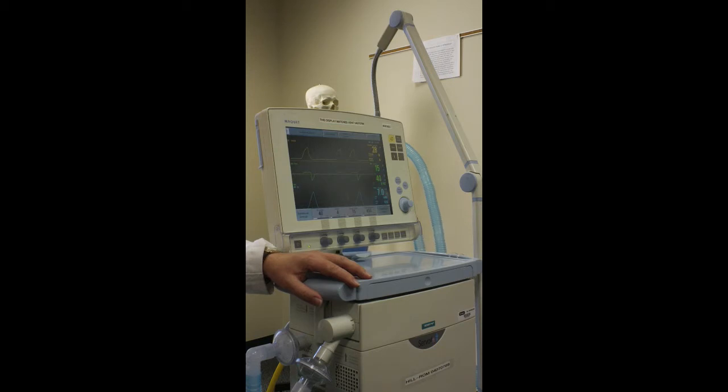Think about the other modes that there are, folks. Switch them to pressure control. Your peaks are too high, you're in volume control, so switch them to pressure control because now you can control their pressures and make sure we don't give them pneumos. But you won't get the same volume. No, you won't, but it's okay to have a lower tidal volume as opposed to a pneumo.